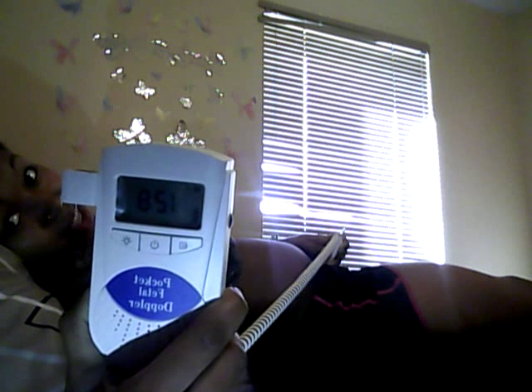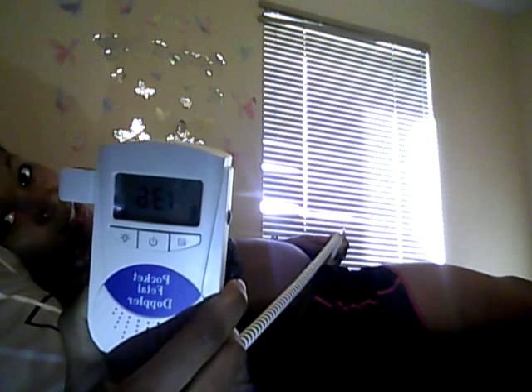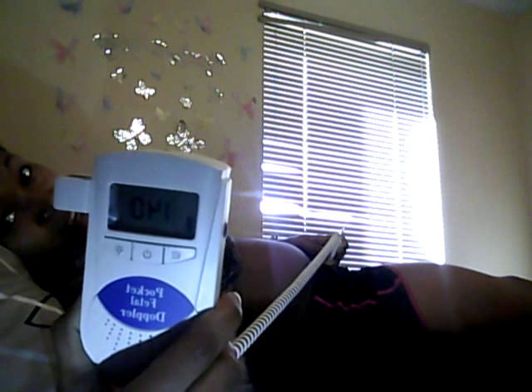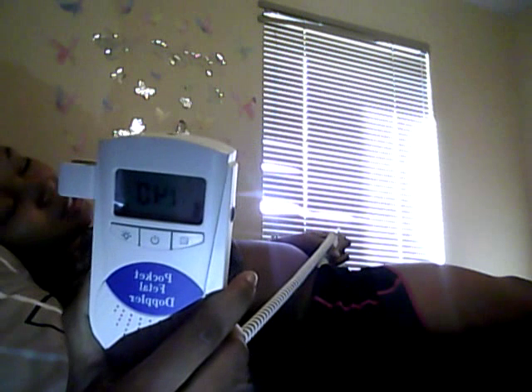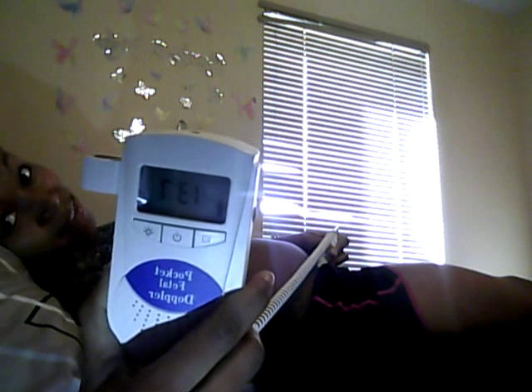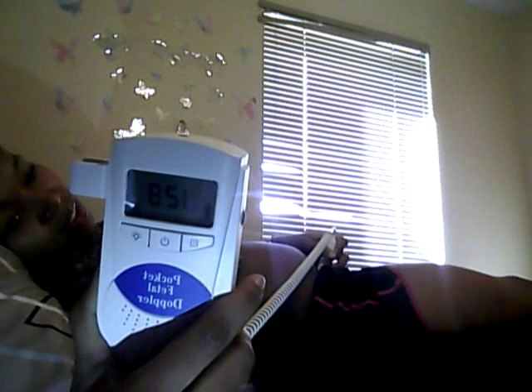There. That little sound, that's the baby moving, that little sound that you just hear, like the little interruption. It's usually louder than that, but I guess he's not moving as much. And I'm saying he because I'm just convinced that it's a boy, so I'm just gonna keep saying he from now on until I really find out. So yeah.